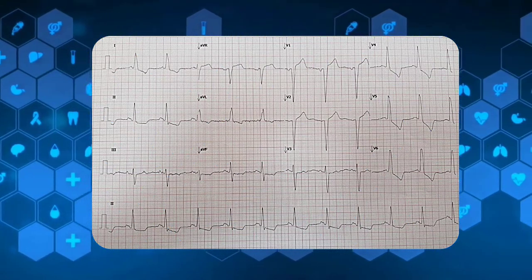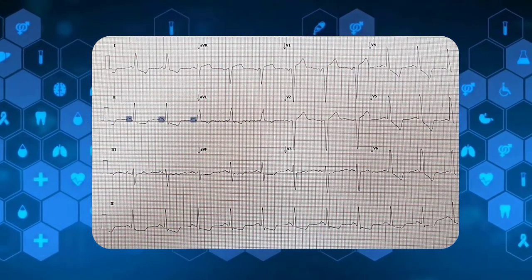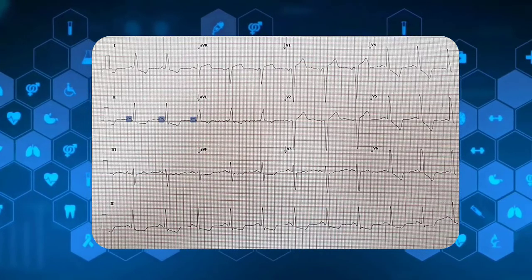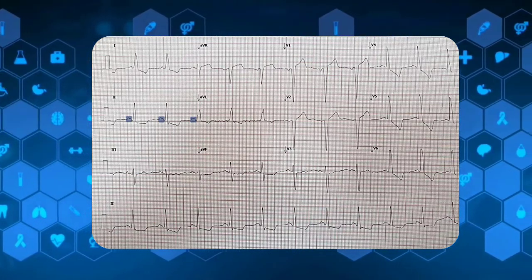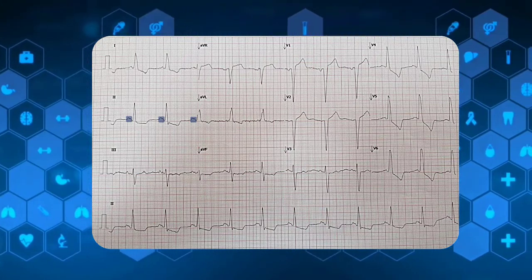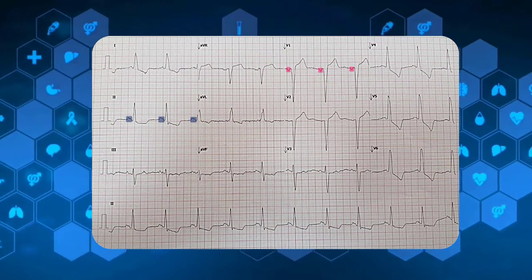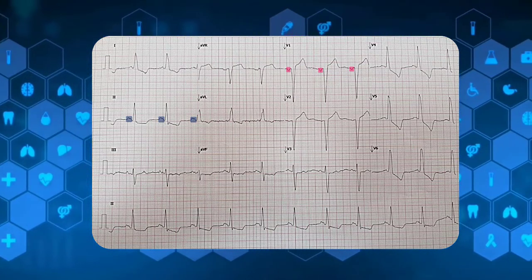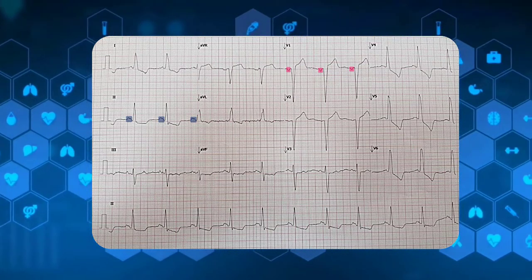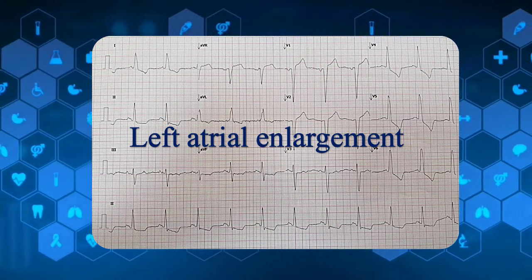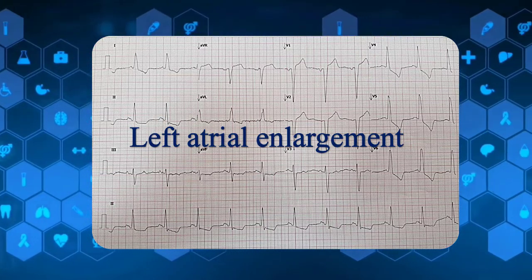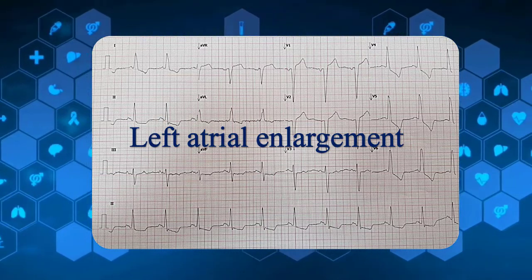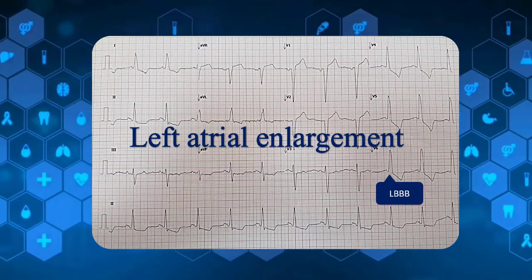Let's go through another example. In this strip, the P waves are oddly broad. The duration of the P wave is approximately 3 small squares. Both the amplitude and duration of the negative portion of the P wave in lead V1 are more than 1 small square. So, according to definition, left atrial enlargement is present. The broad QRS complex is due to left bundle branch block.